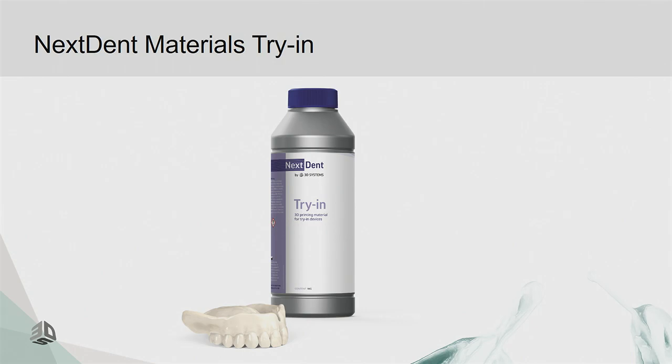I'm a denturist. I've made many dentures, and I would like to check everything. I would like to check the height of the denture. I would like to check occlusion. I would like to check articulation. And the patient would like to see what she or he is getting.